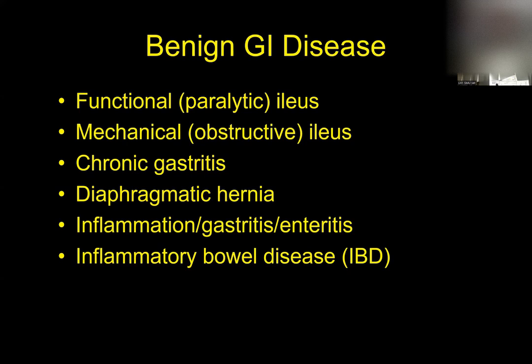And if you can't decide definitively on the radiographs, then your next step would be, let's ultrasound the dog and see if the ultrasound can help me get off the fence one way or the other. Before ultrasound came about, we had to do upper GI series, which is a pain. So now at least we can do ultrasounds much quicker, much less invasive, and a lot more specific.